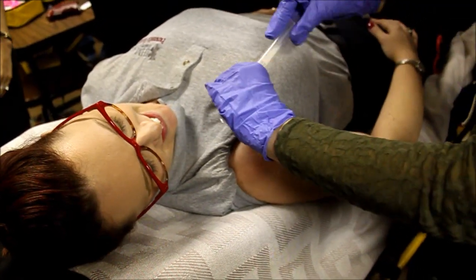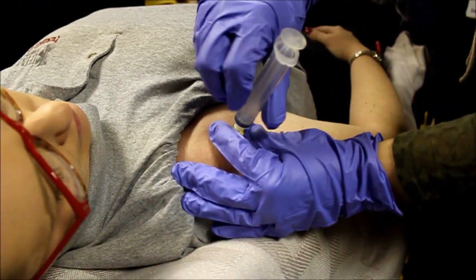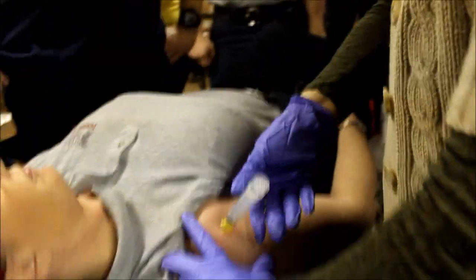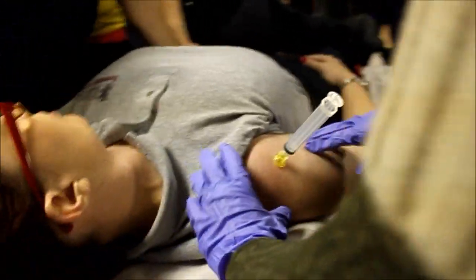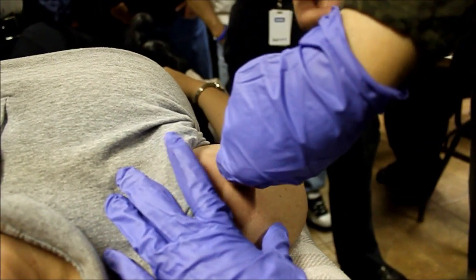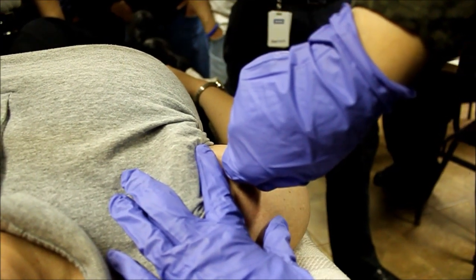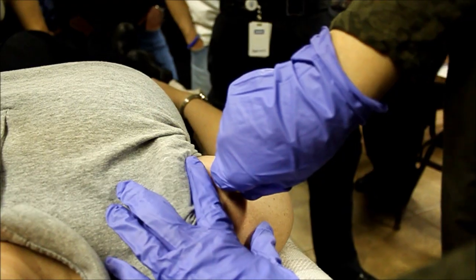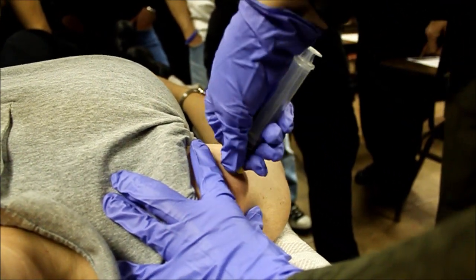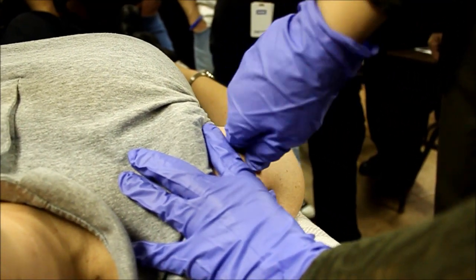Go ahead and remove the extension tubing. Did we talk about removal? So removal is important. You hook up the syringe to the hub, grab the syringe like a handle. Put your hand on top like that. You want to turn clockwise and pull. You don't want to rock it, you don't want to torque it — people sometimes treat it like a nail on a 2x4 and jiggle it around to loosen it up. Don't do that. Just turn clockwise holding the hub with your thumb and index finger; you're using the syringe's leverage. Twist clockwise to break that seal with the bone and pull straight back in one motion — twist and pull, twist and pull. Turn and pull. There you go.